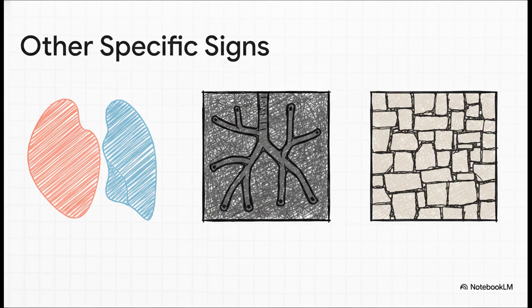There's also the crazy paving sign you'll see on CT scans. It's this crazy mix of ground glass opacity and smooth septal thickening, and it can point to anything from a severe viral infection to pneumocystis pneumonia in immunocompromised patients.